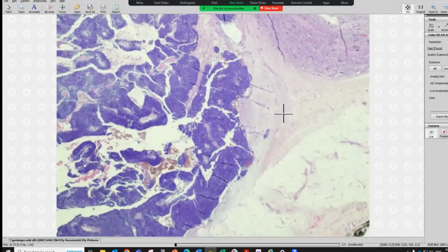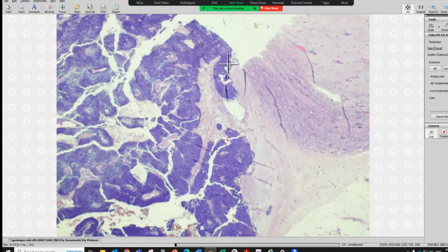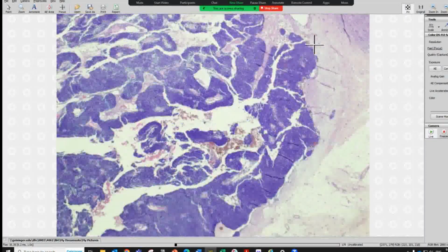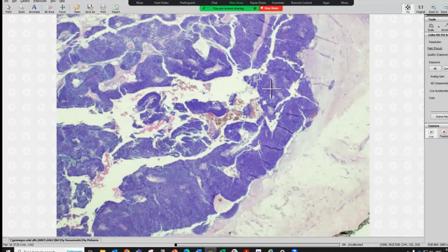And when you see this lesion and normal kidney, we can see this capsule. So this one is really different from the metanephric adenoma. We can see this capsule, and also this bluish, really primitive area. They form kind of pseudo rosette or rosette-like structures.